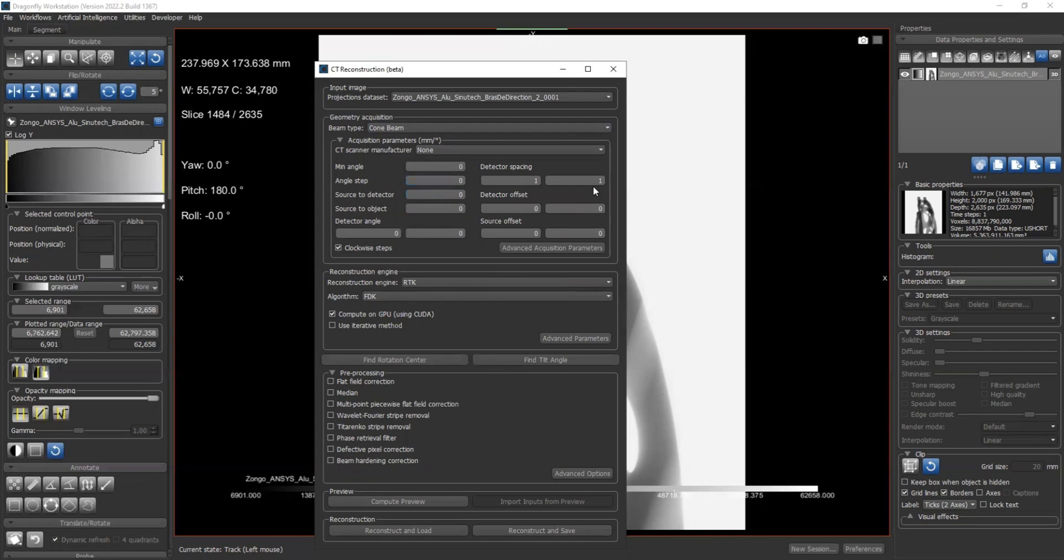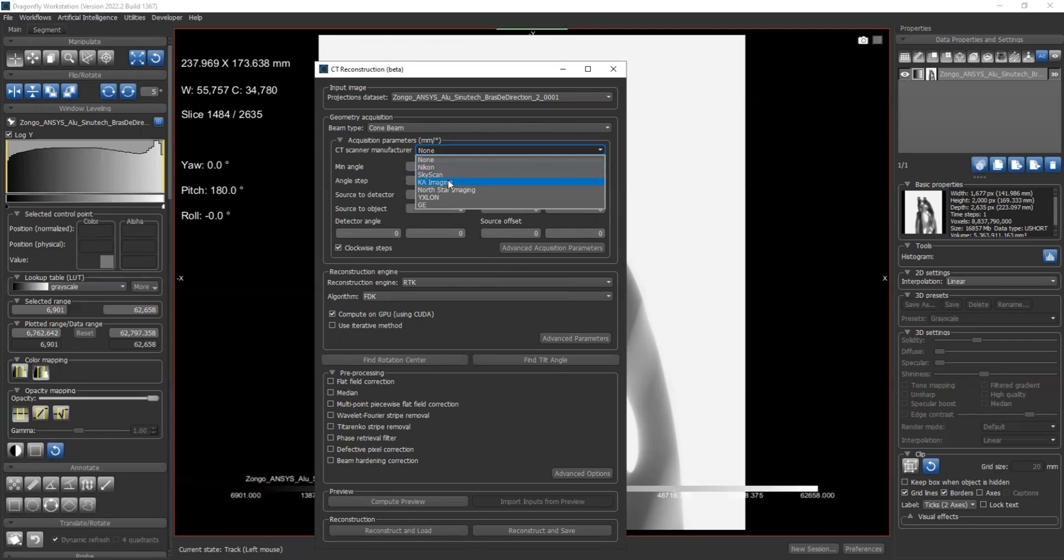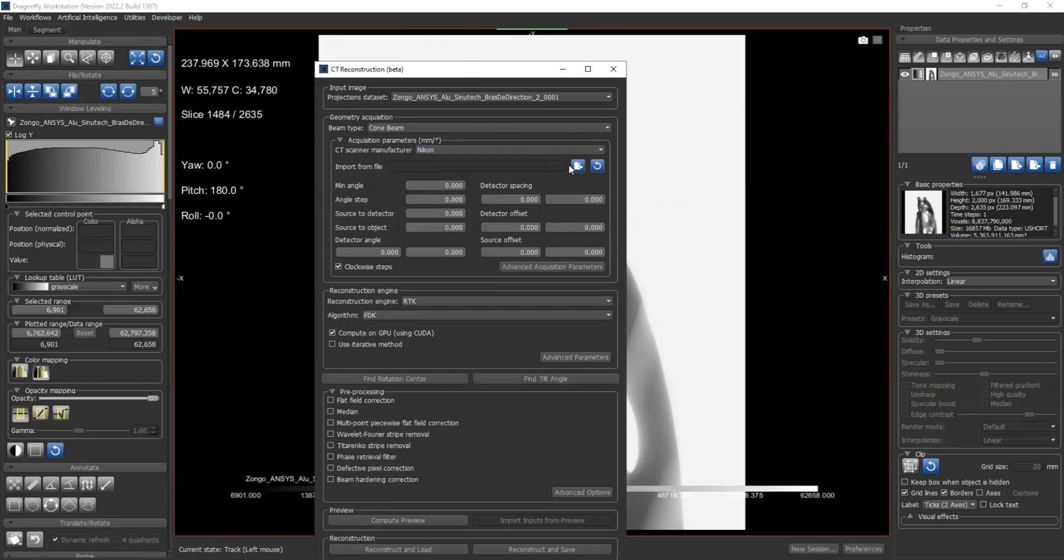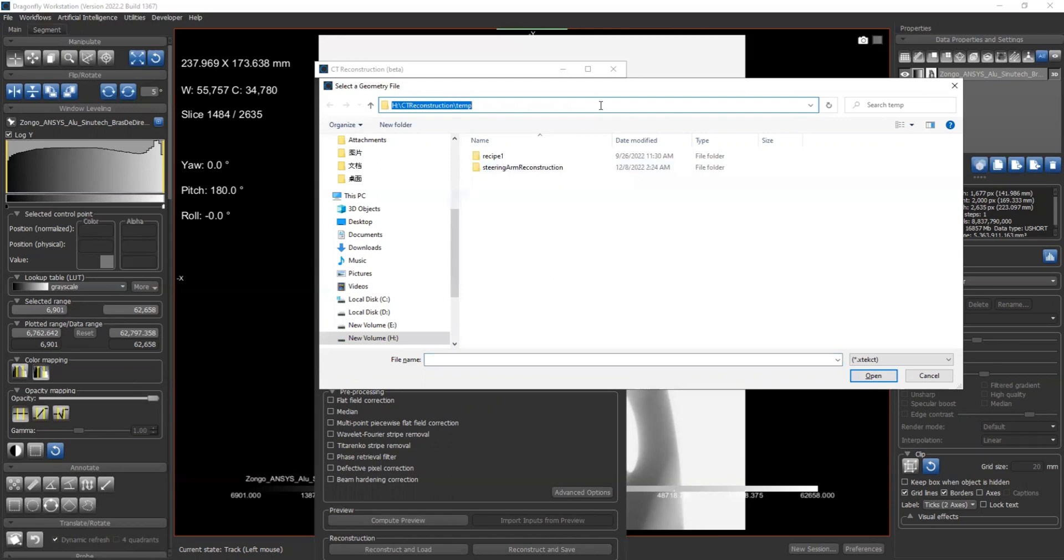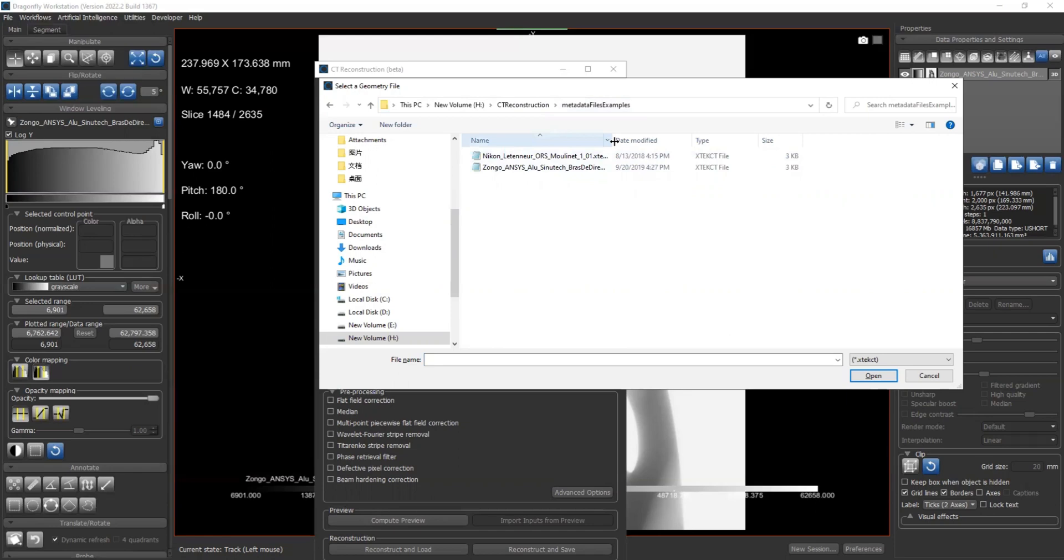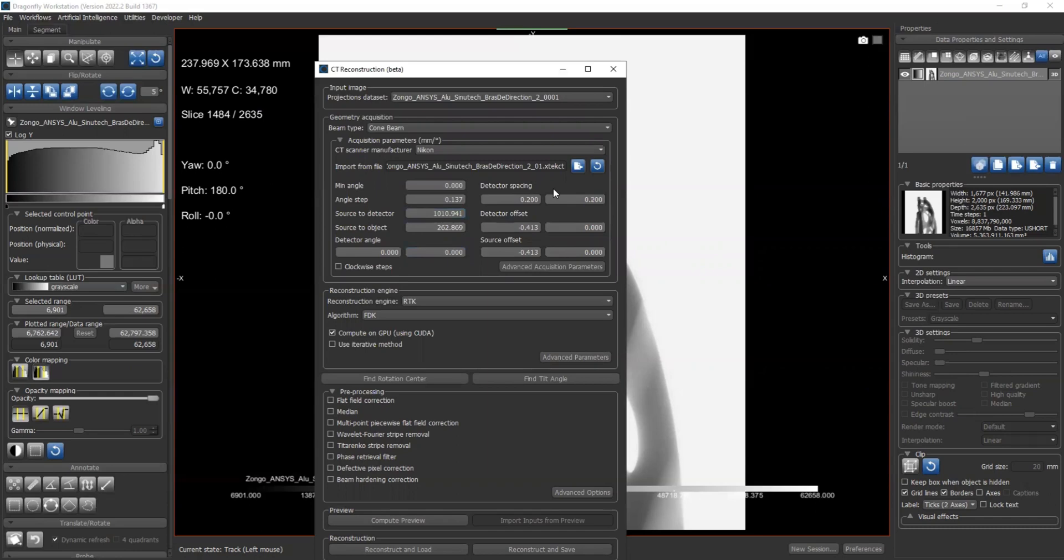You could either, if you know those parameters, fill them by yourself, or if your dataset is from the following manufacturers or vendors, you could select which vendor it is. For example, in our case it's Nikon, and you'd have options to import from files. For Nikon, I need to find my location. Okay, here is my metadata file. So for Nikon, it's an XTEKCT file. You can select it, open, and all the parameters will be automatically loaded.